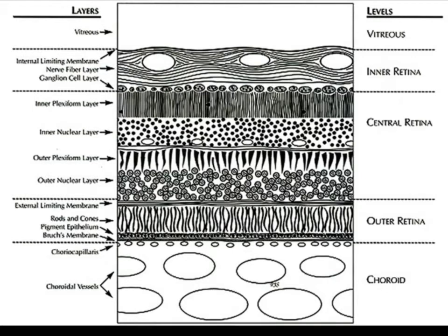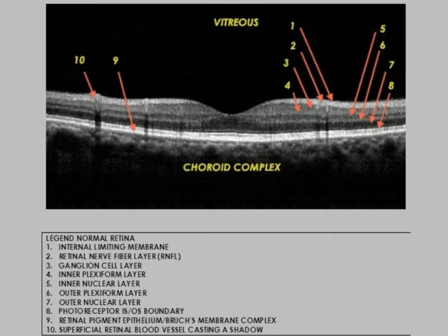See, all of us had to learn the layers of the retina for our board exam. But what's remarkable is that we're utilizing this information on a daily basis with our OCT technology. It's important to understand that we can see every single layer of the retina with these scans. And again, to recalibrate everybody before we move forward, before we can truly appreciate the abnormal, we need to understand the normal and what it actually looks like.